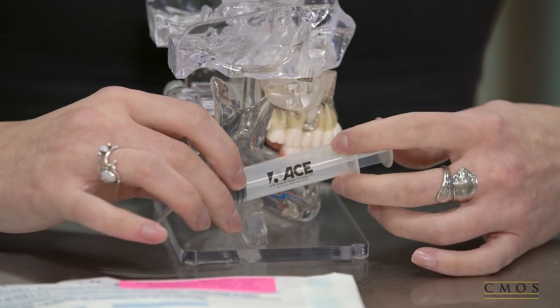Once the water runs clear, you will know that there is no food or debris in the extraction site. It is important to use the syringe until the holes are gone, as food can get stuck and trapped and you do not want the holes to close over any debris left in that area.